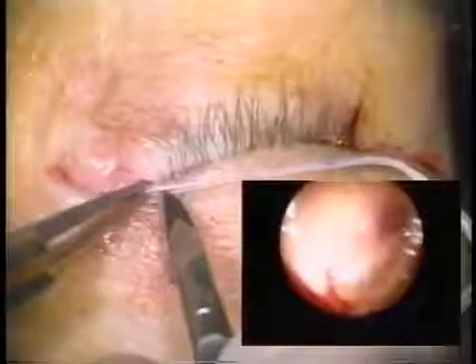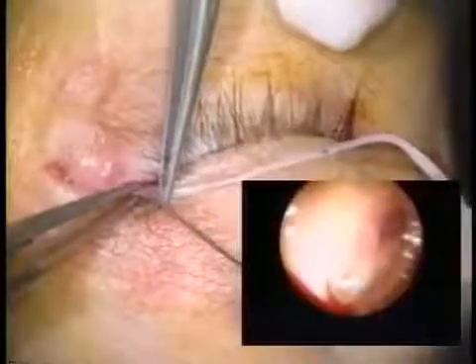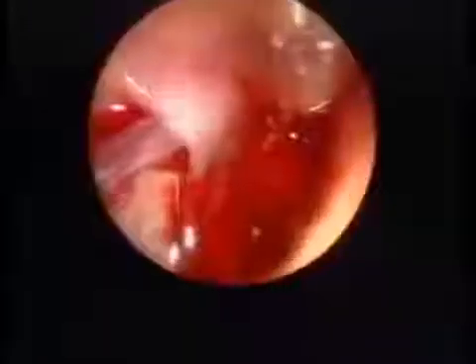The tip of the tube does not appear from the opening of the nasal lacrimal duct because of slippage of the metal probe in the tube. A second small cut is created, and from the second cut the metal probe is inserted to push the tube. If the tube is the step NST, in which the nunchuck tube has steps on the inner surface, this procedure is not required.